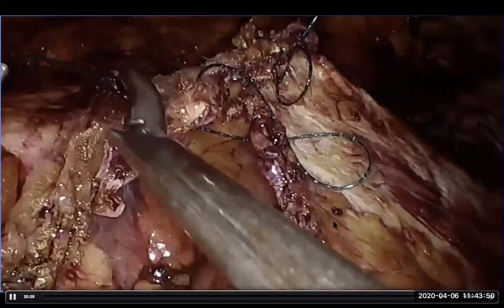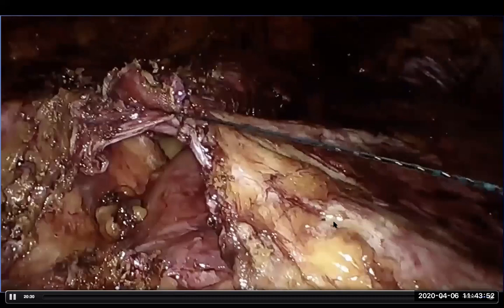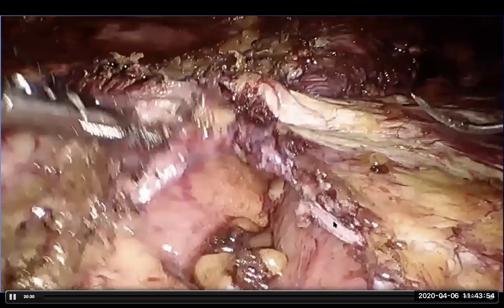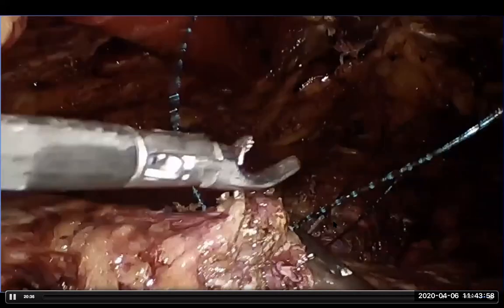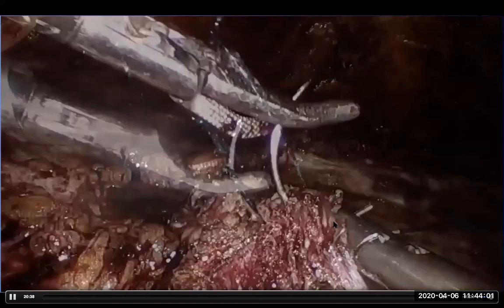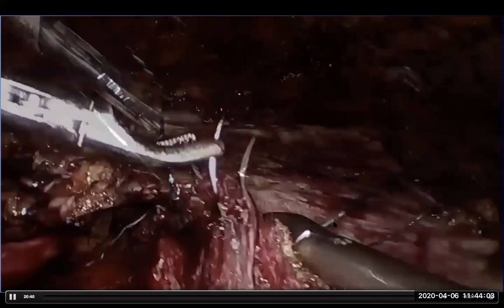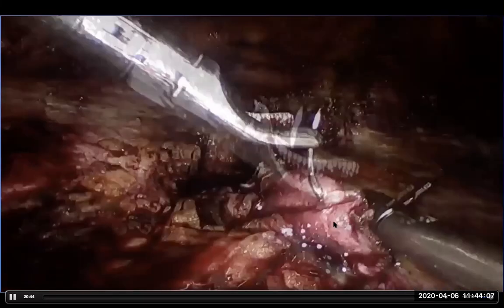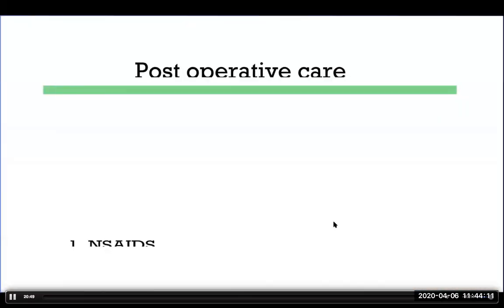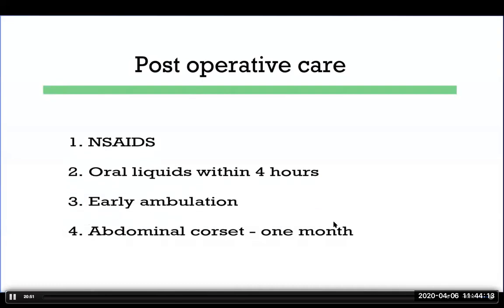One important consideration is that the peritoneal sac must be on the floor. It should not be tented up. It should not come down from the sides. It should lie flat horizontally on the floor. If you don't have that flat, it means there is still tension on the suture line. You see that? That should be a horizontal peritoneal fold.